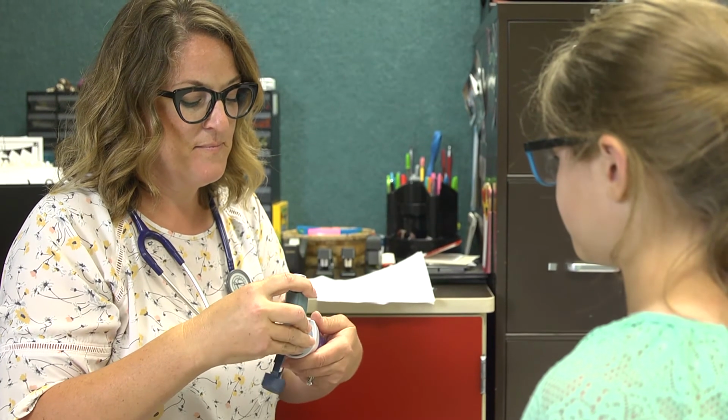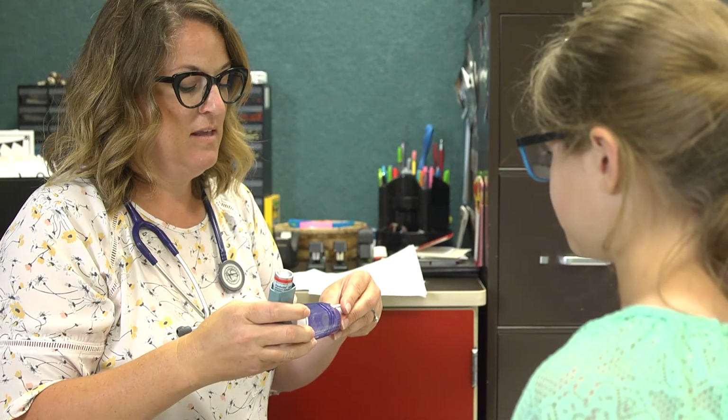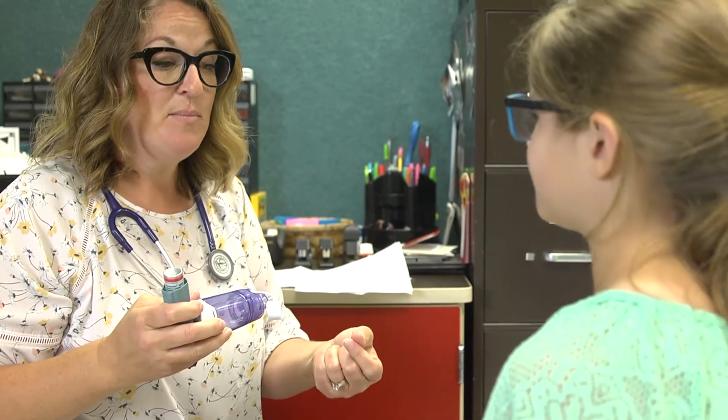Procedure for inhaler with spacer. Place the inhaler mouthpiece onto the end of the spacer. Hold the inhaler between your index finger and thumb. Have the student stand up and take a deep breath in and breathe out.